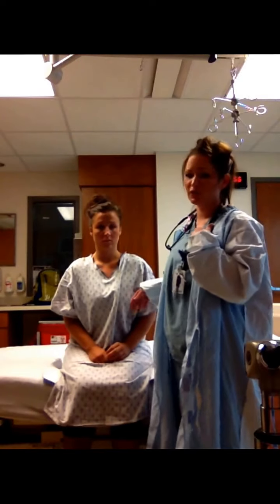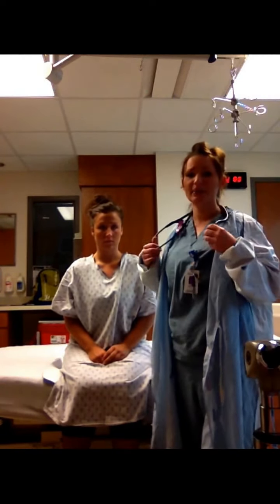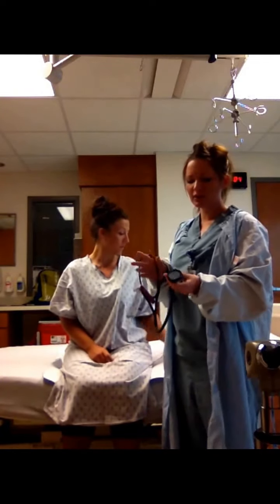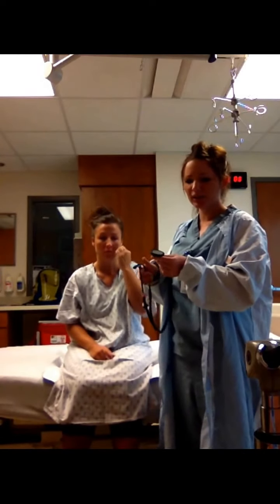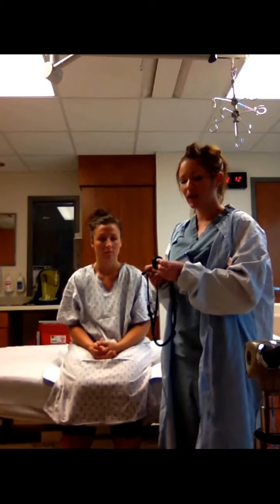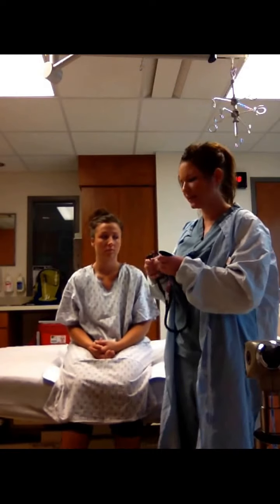counting. Here you are also supposed to count an apical pulse for a full minute, but for the purpose of this video, we will cut it to 30 seconds and times that by 2. With a stethoscope, there's normally a bell and a diaphragm. This is a self-tuning stethoscope, so to hear any kind of murmur or anything like that, you would apply a light amount of pressure. For today's purposes, we will be applying a little bit more pressure to hear normal heart sounds.